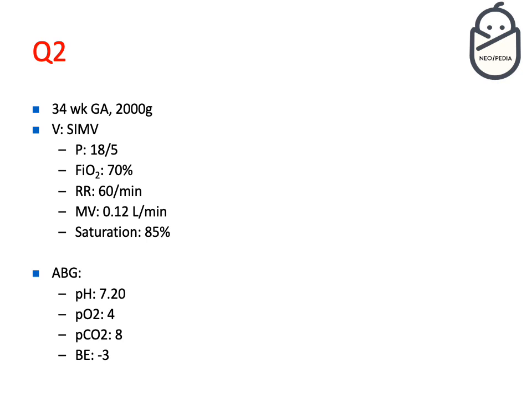I have also attached the gas down there, and you can see that the oxygenation is not great really. It's 4 kilopascal, and the CO2 is 8, which is high. And you can see the pH is acidotic here. So what you can do in this condition, what's the main issue now is the low saturations and the high CO2. All right, and what can you play with?